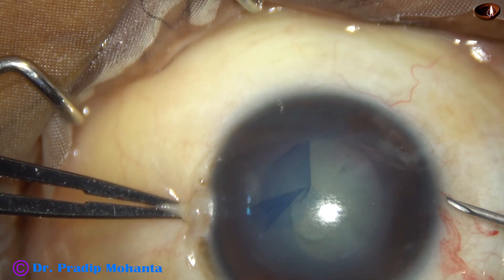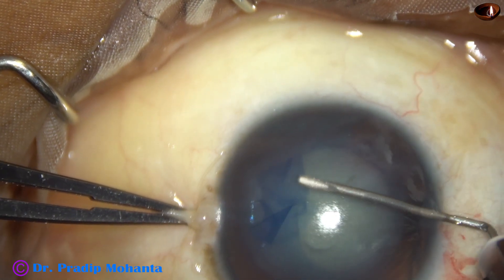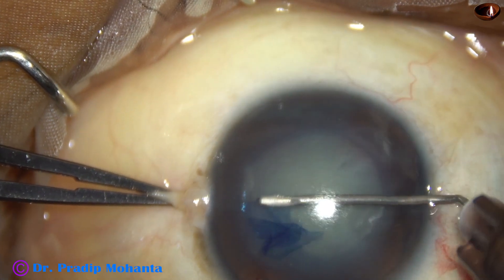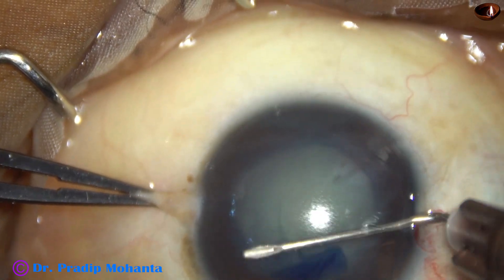Then, I use the needle to complete the rhexis. In this area, there is no zonular tear and the needle can be used.